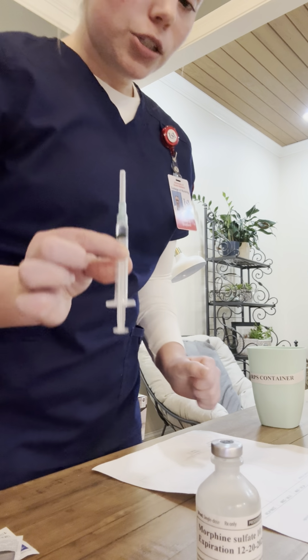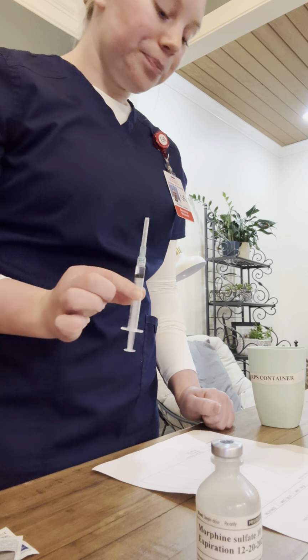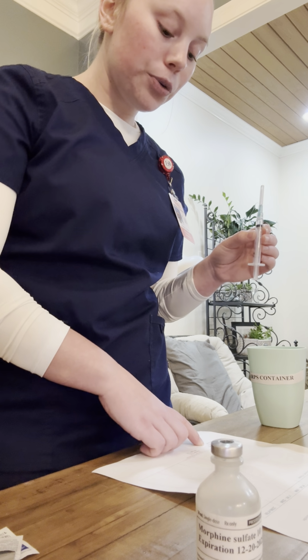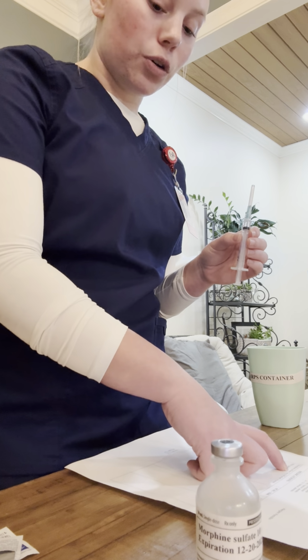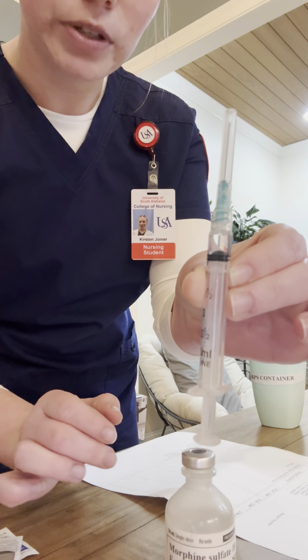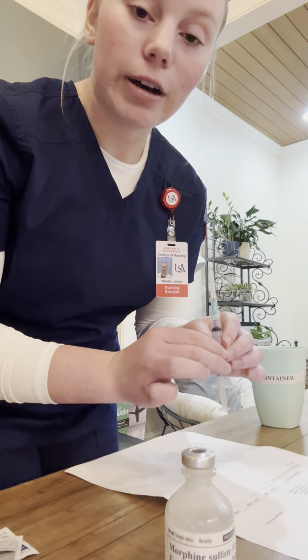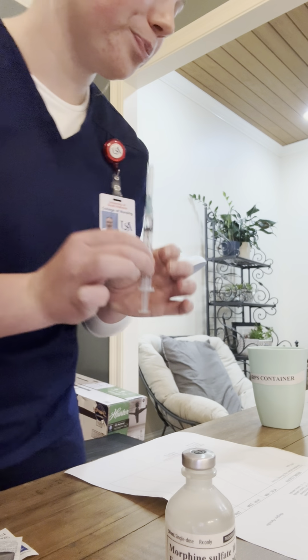So now that I have my medication drawn up, I'm going to move to my second check for accuracy, which again are the 7 rights. So my correct patient is Jaguar J. Jones, medical record number 417-6352, allergy to penicillin. My right drug is morphine sulfate. I have my vial of morphine sulfate, and that's also what's drawn up in my syringe. My right dose is 5 milligrams, which also translates to 0.5 milliliters. And I have 0.5 milliliters in my syringe.